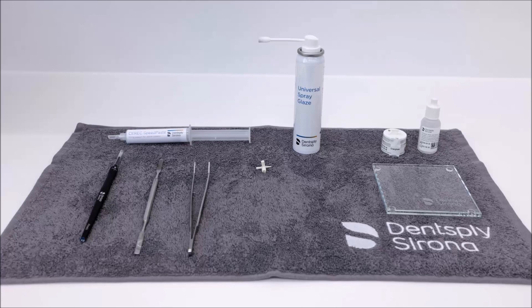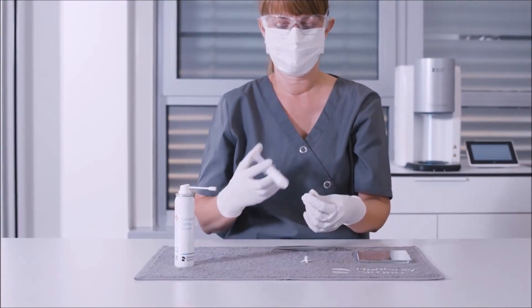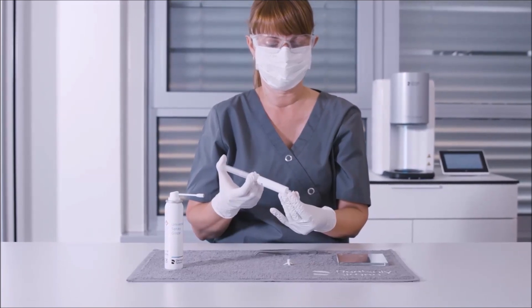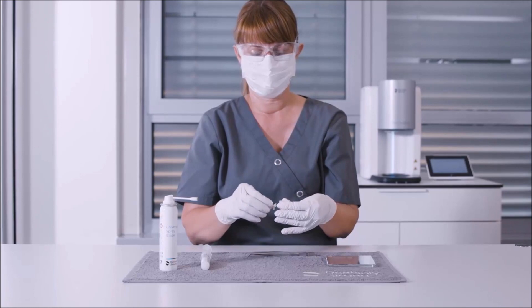If you decide to work with the spray, as in the example here, please make sure to wear a mask, safety goggles, and a pair of gloves. Before we start to apply the glazing material, we make sure that the restoration is free from debris and completely dried with oil-free air. We fill the interior of the crown with just enough CEREC Speed Paste to support the firing pin without overfilling the interior of the crown. Next, we carefully place the crown on a firing pin.